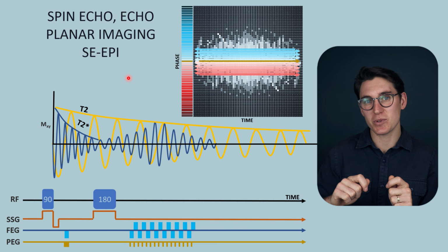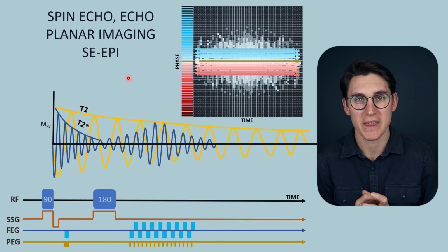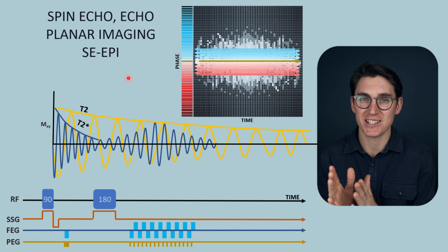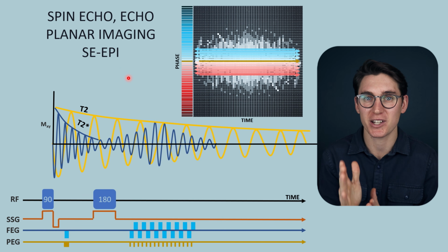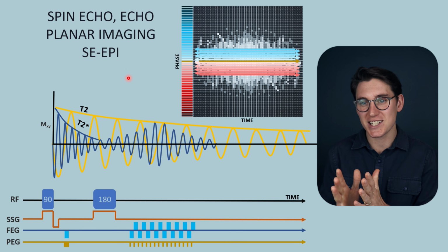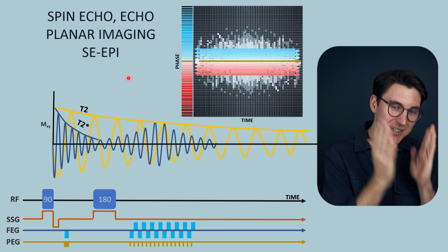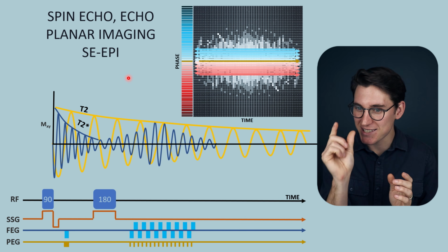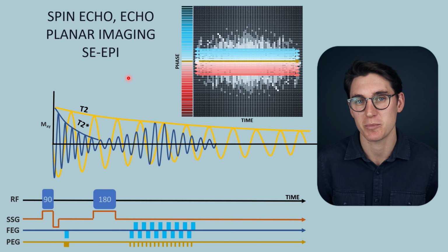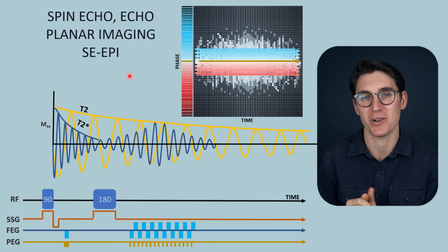And as you'll see, as we go to DWI imaging, we go to tensor imaging, look at functional imaging, there are certain image techniques that require rapid detection of signal at a set point in time, especially when it comes to DWI imaging, which we're going to be looking at in our next talk. We want to see what's happening right now at this given point of time and compare it to a different point of time. And if we can take a snapshot of a single slice rapidly, that allows for those comparisons to be more accurate. And that's going to become very necessary when we go into DWI imaging in the next talk.